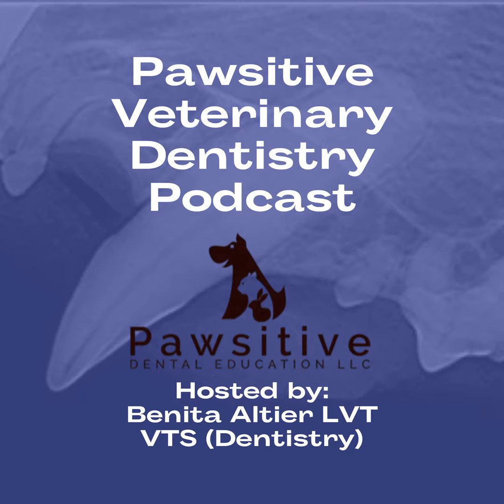If I still think this kind of still looks sketchy, but not sketchy enough for me to say let's just remove it or treat it, I use the other side as a control. So I'll put up the two images adjacent to one another to compare the two sides.